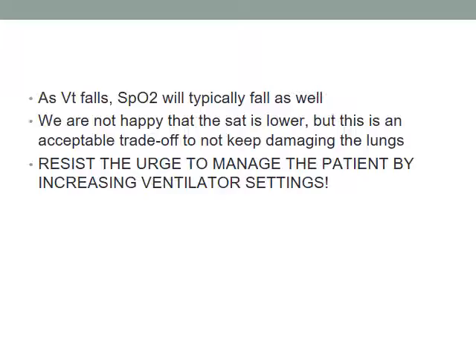This is his ventilator. Anybody notice anything funny or unusual on this ventilator? And you don't all have to speak at once. Tidal volume here is 27. Minute ventilation is 0.43 liters. Great pressures. Peak pressure of 22. No damage to the lungs occurring, and no ventilation at all. So, patient is 94% sat. Pretty good, with no lung function.